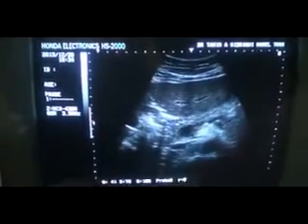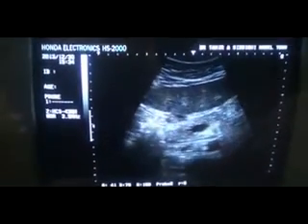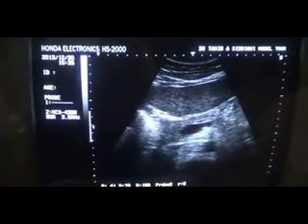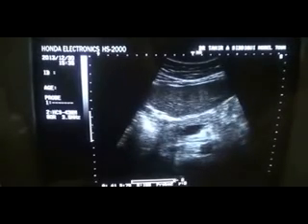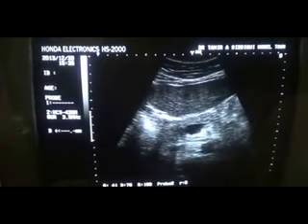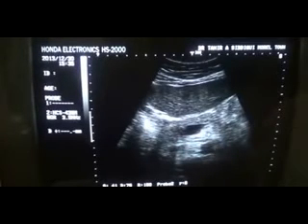I have placed the probe in the epigastric region coming a bit downwards. Here I am seeing a cystic area surrounded by an echogenic rim. This is the pancreas, this is the portosplenic confluence, this area is the superior mesenteric artery in transverse section — remember it is bounded by an echogenic rim. This is the aorta.